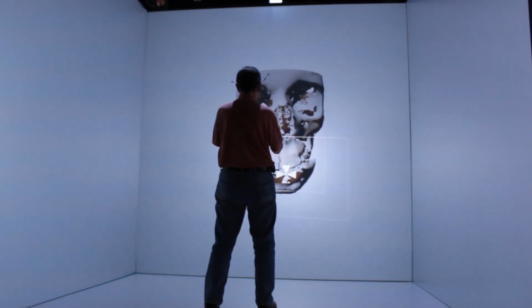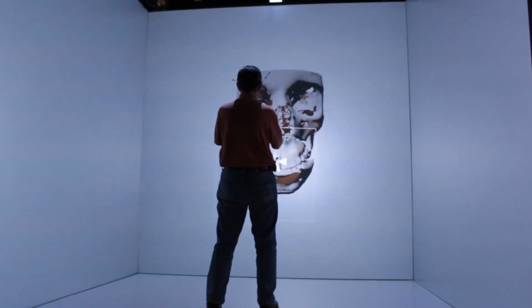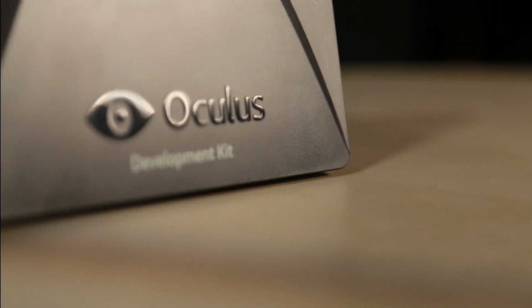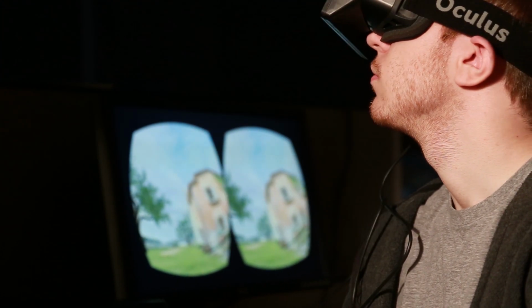Unfortunately, though, because I am at the School of Dentistry, which is a little bit away, a portable option was an important part. Luckily, at the 3D lab, they were also working on a portable type of VR equipment called the Oculus Rift. The Oculus Rift is a virtual reality device. So for this device, you put it on and it completely immerses you in your virtual environment. The Oculus is ideal because it can be mobile.